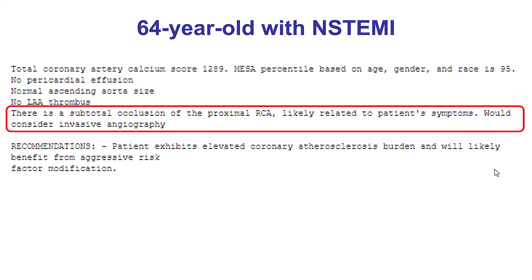The patient was a 64-year-old gentleman who presented with non-ST elevation myocardial infarction. As is commonly done at our institution, he underwent a coronary CT angiogram. These images show the subtotal occlusion of the proximal right coronary artery.